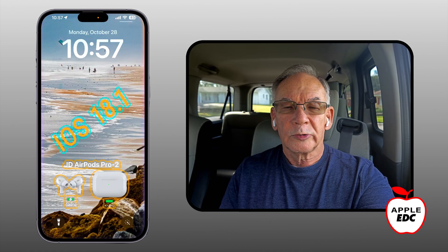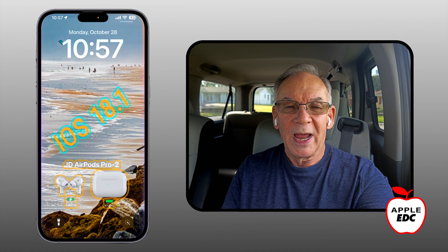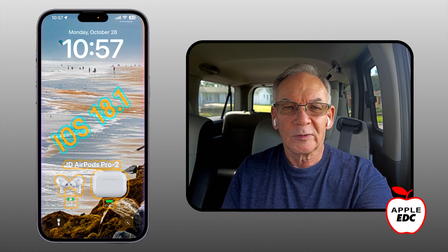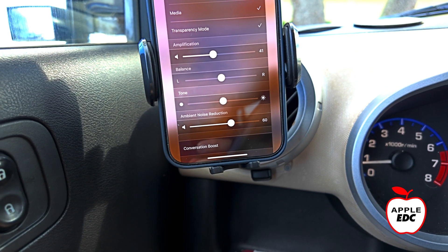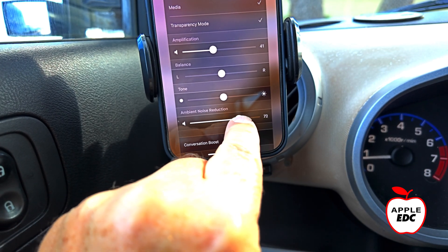I'm on my way to the grocery store, and what a great opportunity to test the hearing aids feature of iOS 18.1 with my AirPods Pro 2 earphones. One of the things that I find really handy is being able to adjust the hearing aid parameters through the control center on the fly.